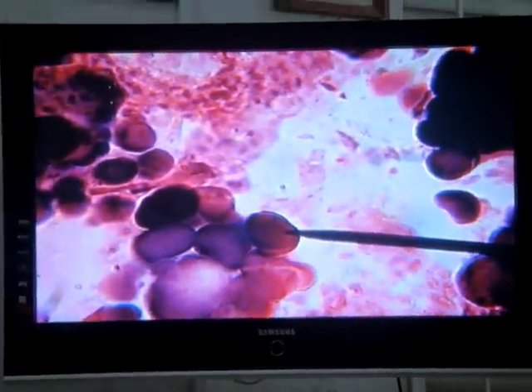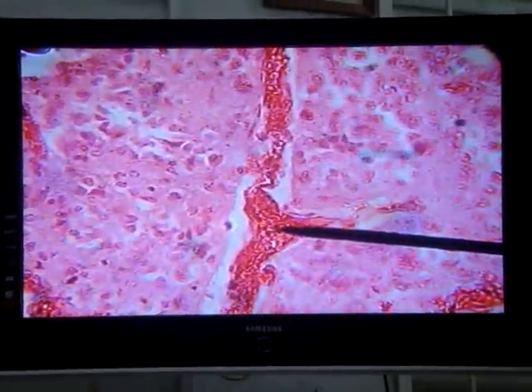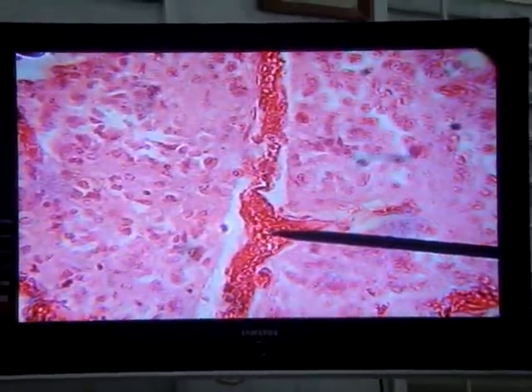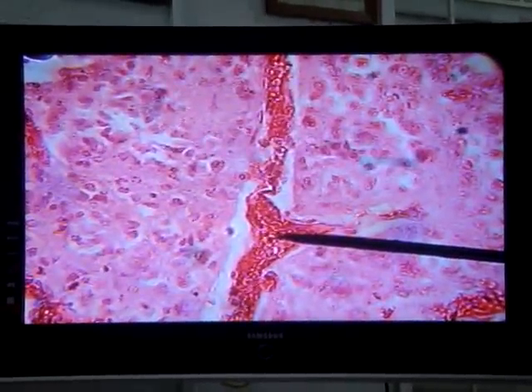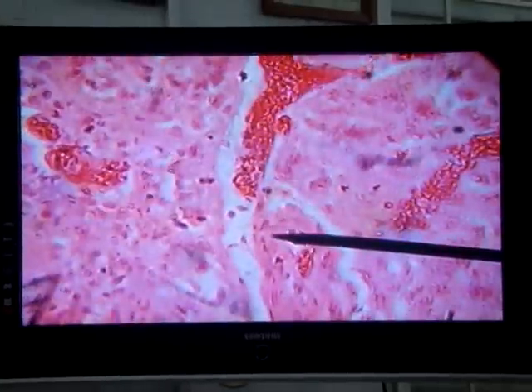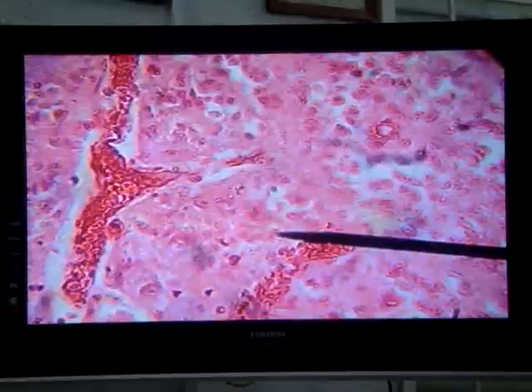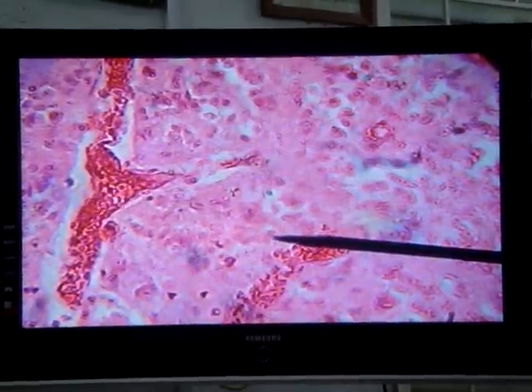Now these brain sands are actually accumulations of calcium carbonate and calcium phosphate in the secretory material that comes from this gland. So this occurs with age. Pre-pubertal subjects do not show these, but with age, as you get more and more mature, they accumulate more and more.